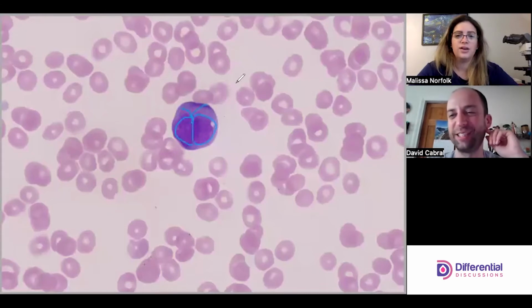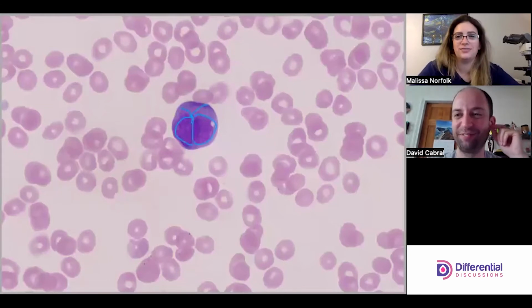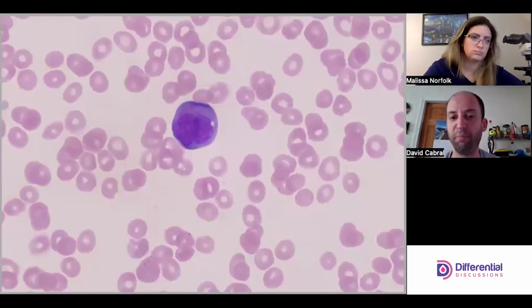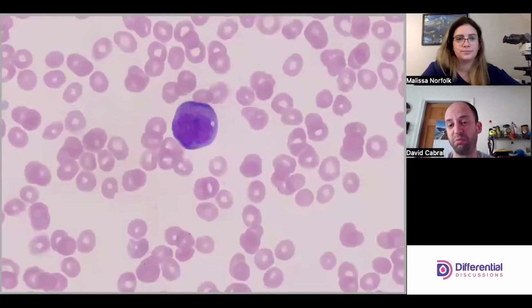That's why they call it a butterfly, because it looks like you've got two little wings together. It's not uncommon for neutrophil lineages to want to lobe up, but that does not happen at this early a stage. So that ends up being a really important characteristic where we can look at these and guess the leukemia and know what we're looking at.